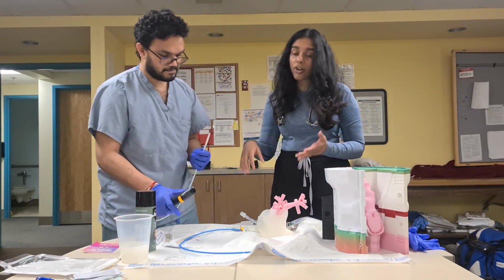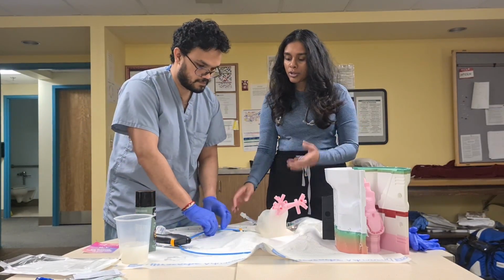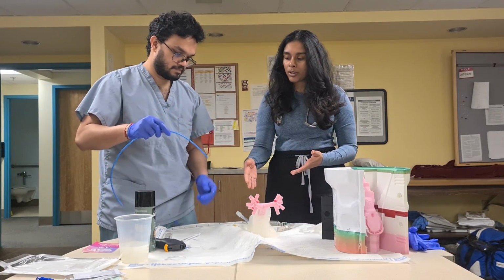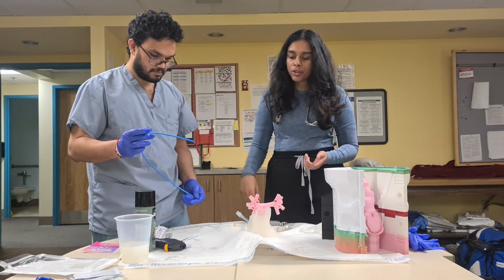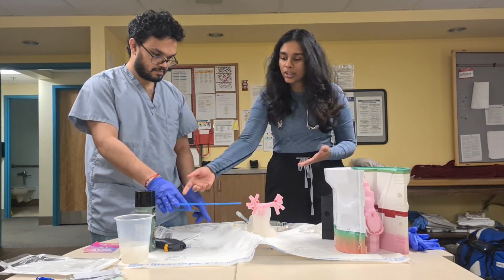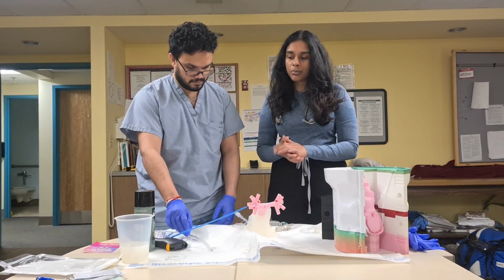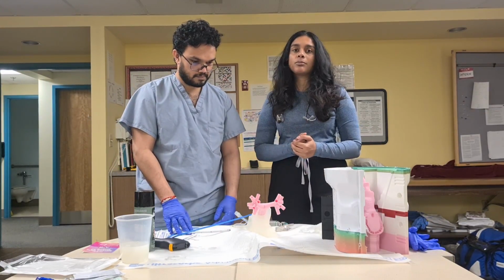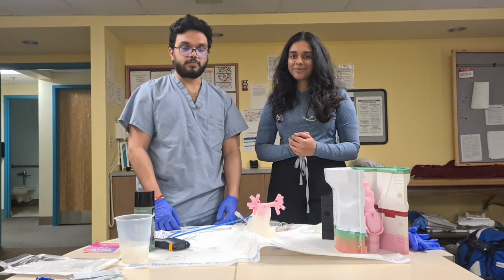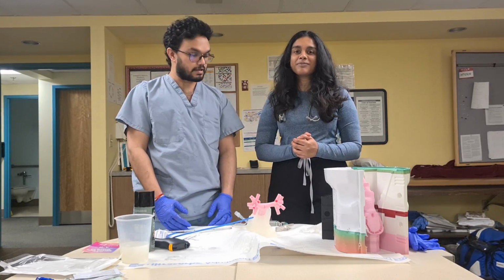When we use the model, there would be two additions. One would be, obviously, a syringe attached over here to inflate the cuff, and to double check and make sure that we're in the trachea, we take the bronchoscope and go through. At that point, we'd have it attached to a camera, so we could use the bronchoscope and go through all the different bronchi and basically confirm that we're in the right place. So we'll give more updates as this project grows, but thank you all for kindly listening to us.